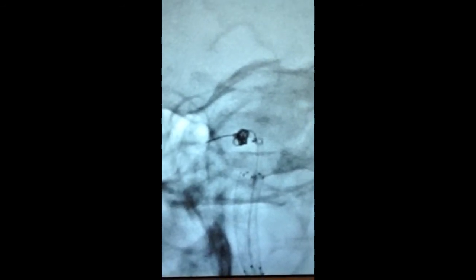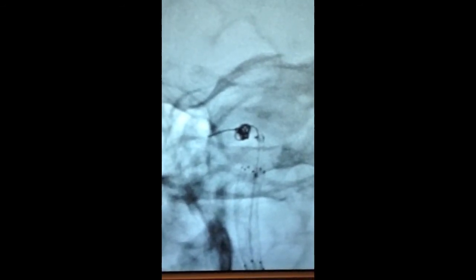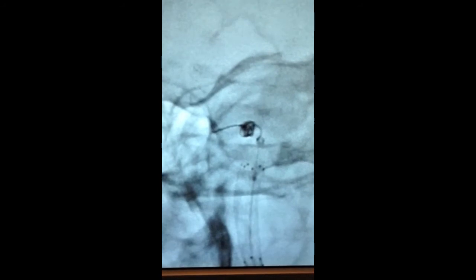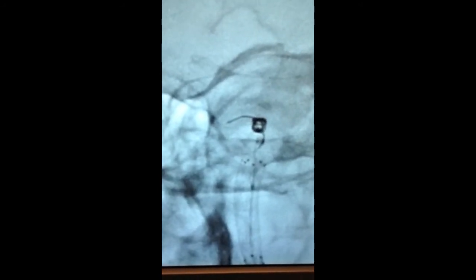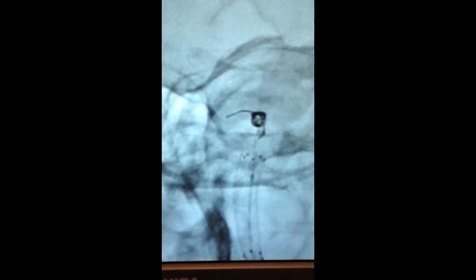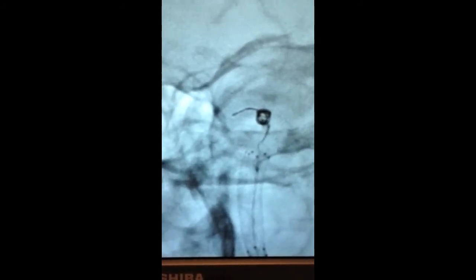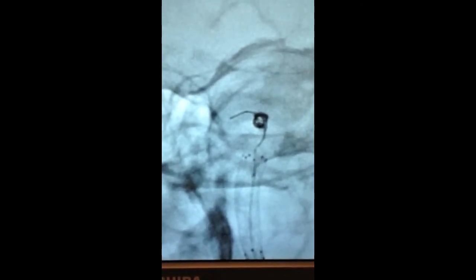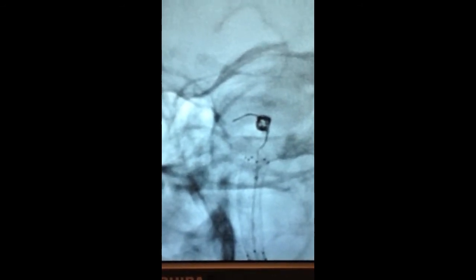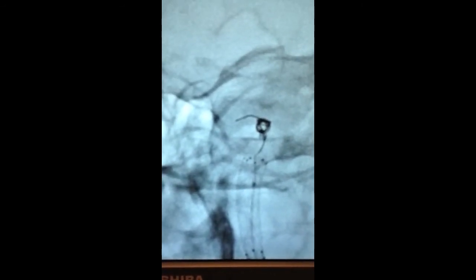We see that we are working through our stent at this point. The stent is seen opened up at the bottom half of the screen. The MERCY device is slowly being pulled back towards the catheter to pull out any clot.